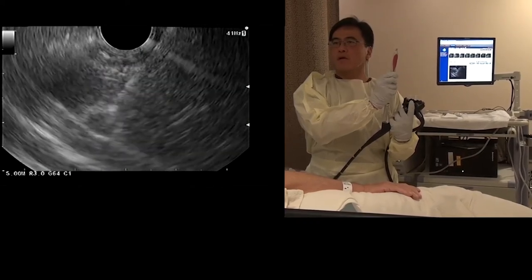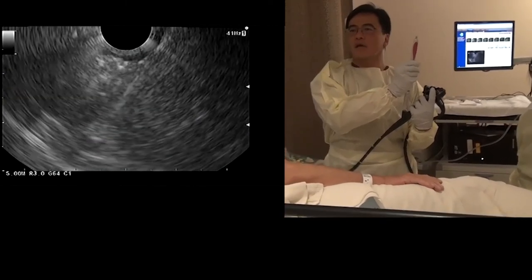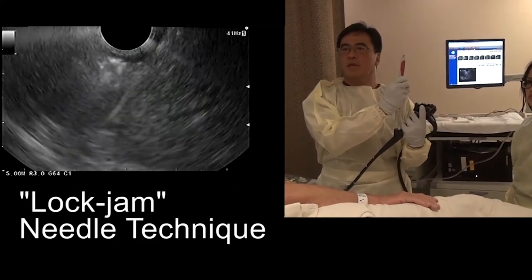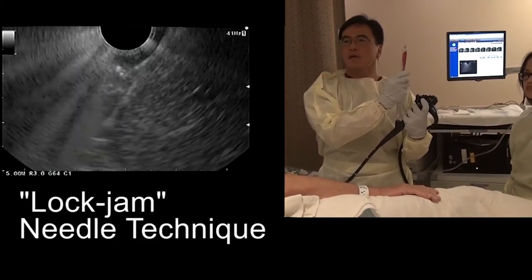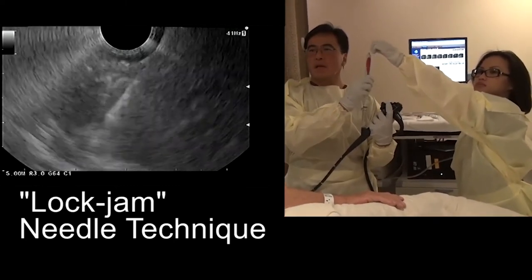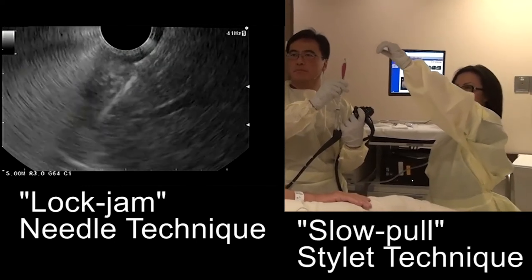Okay, here we are. We're right in it now. We're gonna lock jam again.